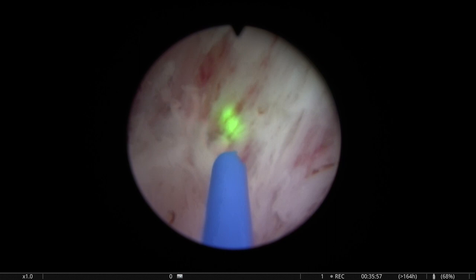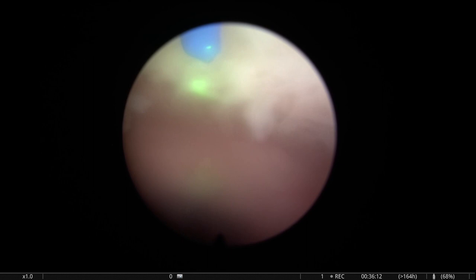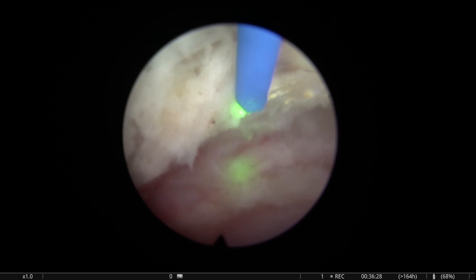Just have to find if there's any vessel bleeding, these pumping blood vessels, which can obscure visibility and can complicate the postoperative recovery. Here I realized that I left, you see, some tissue, but this is not so important. I think this is something you can perfectly do at the end of the operation.